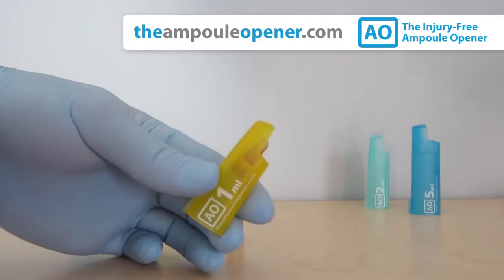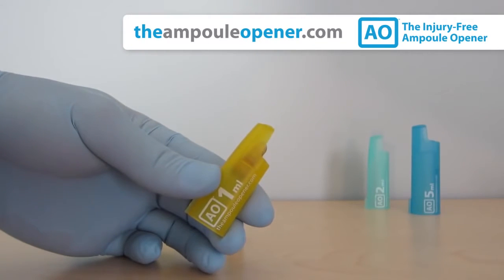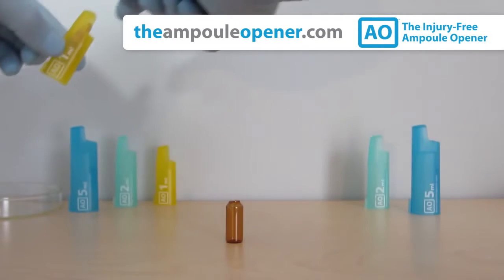The ampule head is safely secured in the AO for your protection. To eject it, gently push it out into a sharps container.